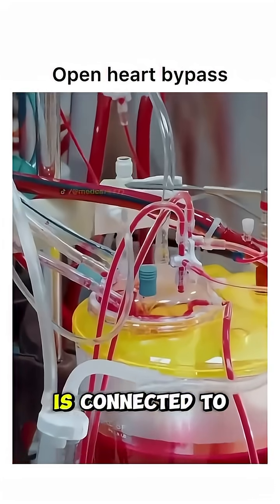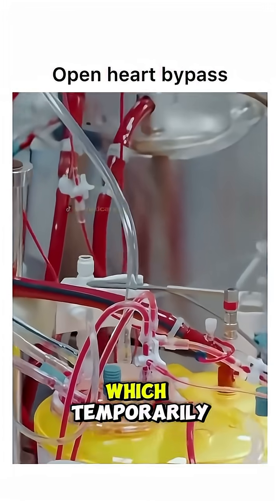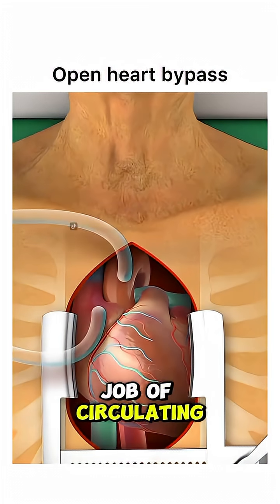Then the patient is connected to a heart-lung machine, which temporarily takes over the job of circulating blood and oxygen.